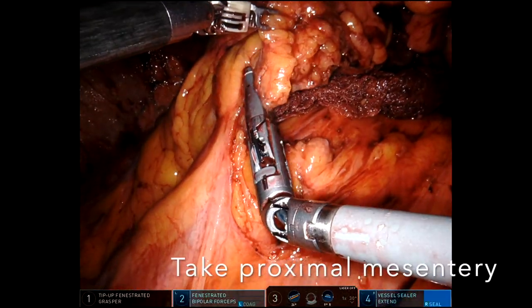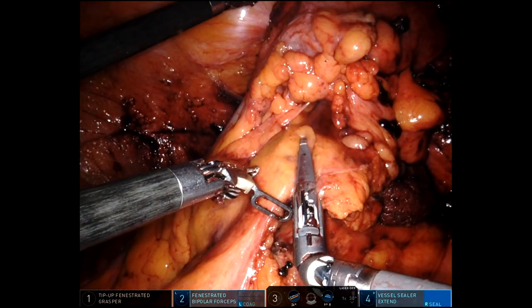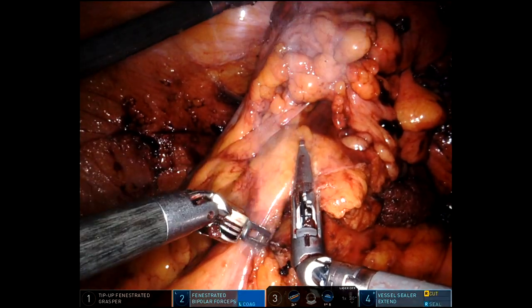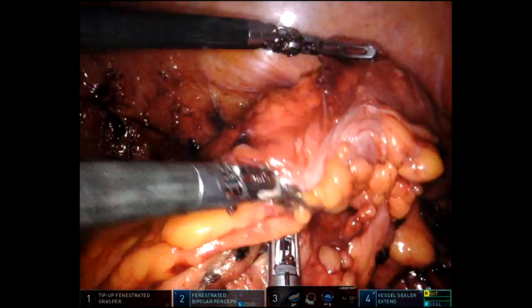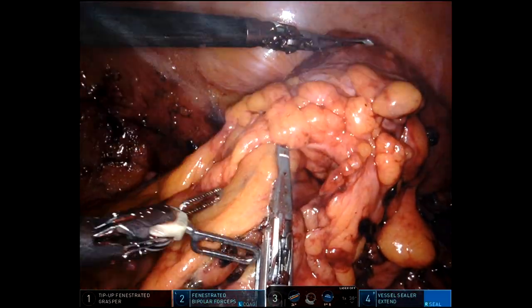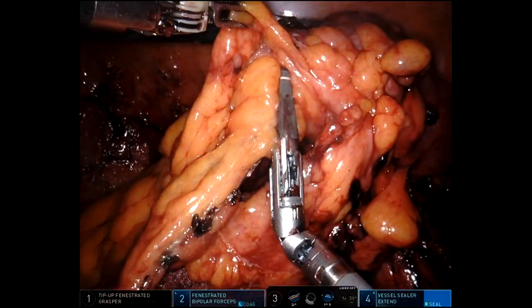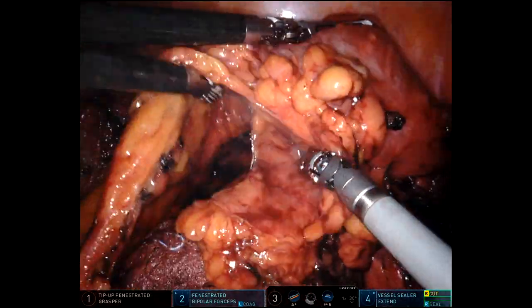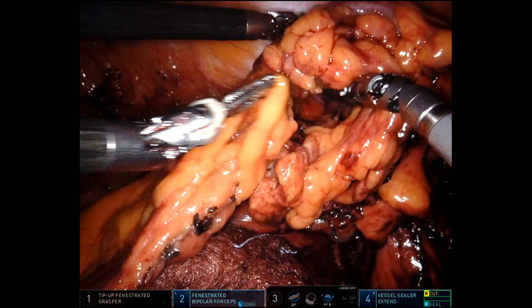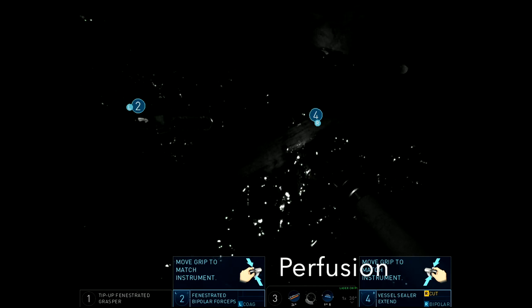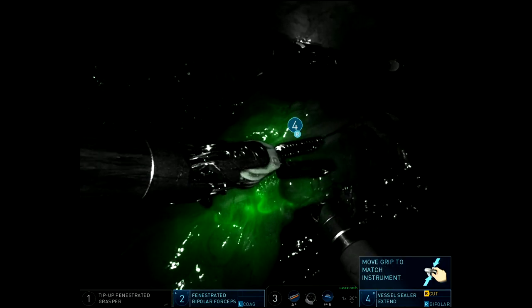Now I'll take the proximal mesentery. As mentioned, I previously took down the entire splenic flexure. I also went ahead and took the IMV right at the duodenum in order to get adequate length — I just edited that out for time. After having done these maneuvers, I had more than adequate length to reach for basically a distal colorectal anastomosis.